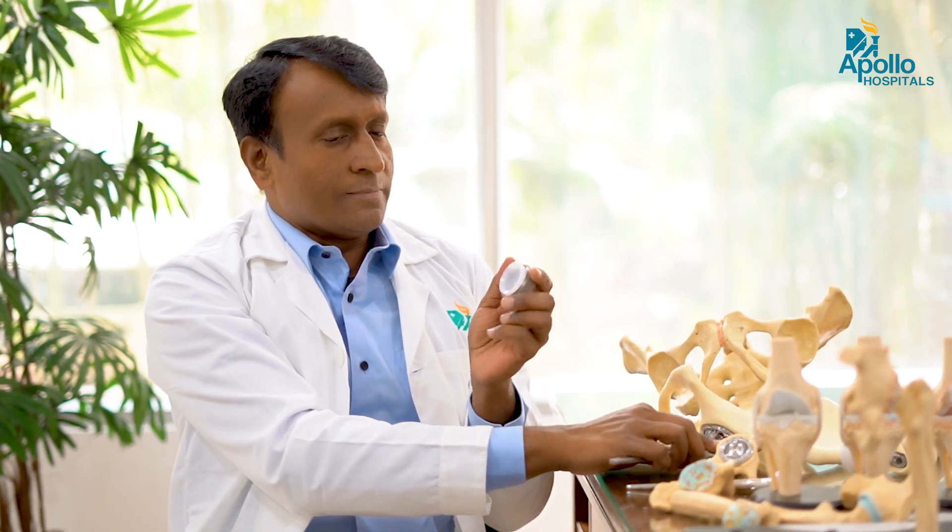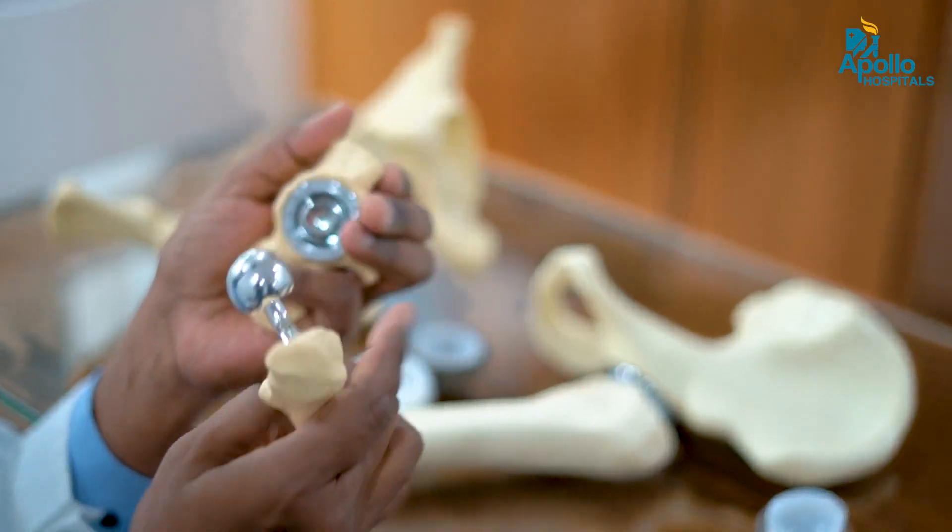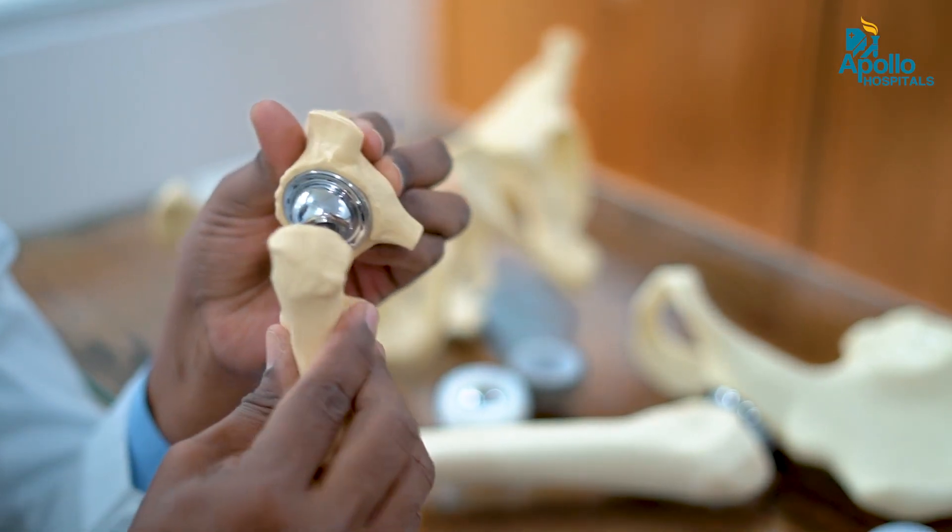Ceramic on ceramic is another bearing surface option — instead of poly there is a ceramic liner, a pink-colored liner. The problem with ceramic on ceramic is that it is a hard-on-hard surface which can cause a squeaking sound and can also cause chip fracture of the ceramic. Metal on metal was used earlier but is no longer preferred. The ideal best bearing surface is ceramic on poly, which has already shown results of 20 years and is expected to last up to 30 years.